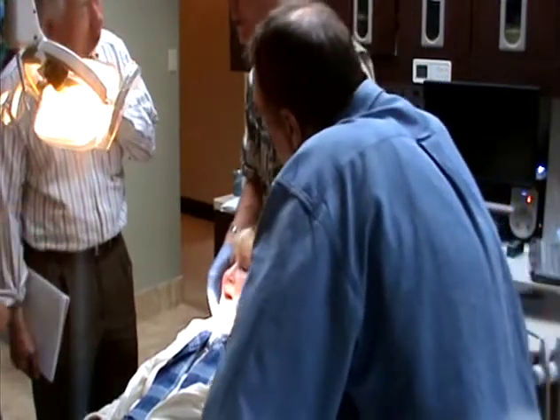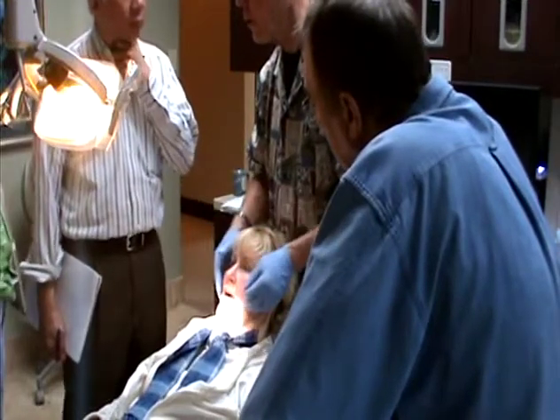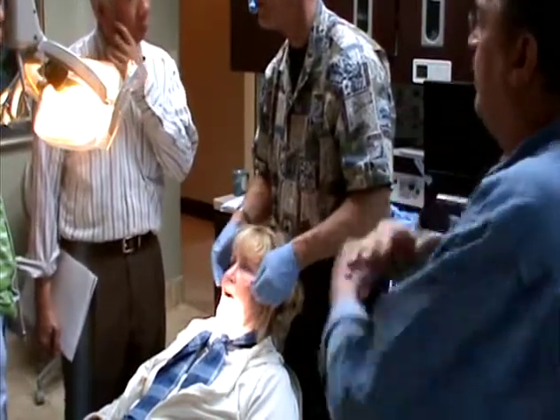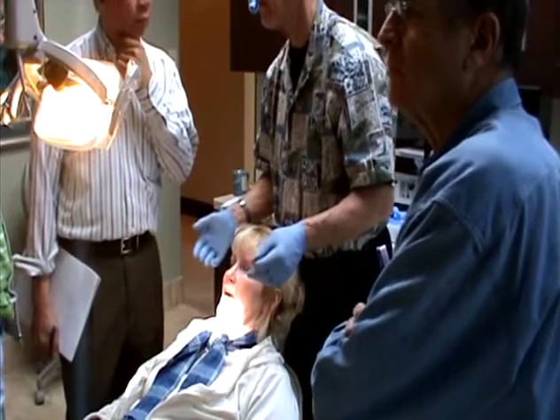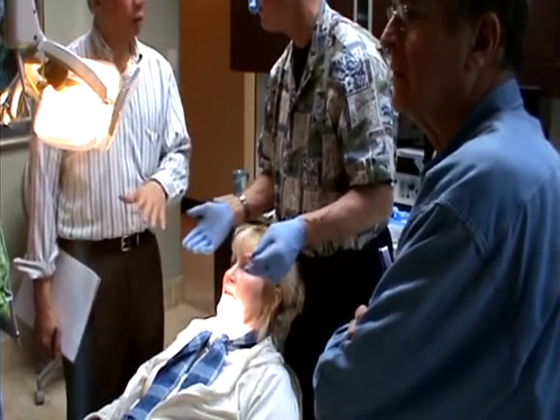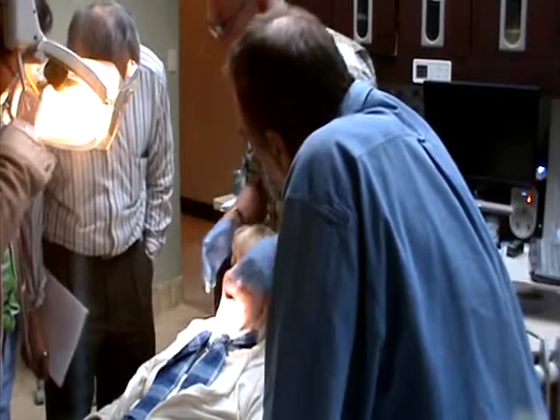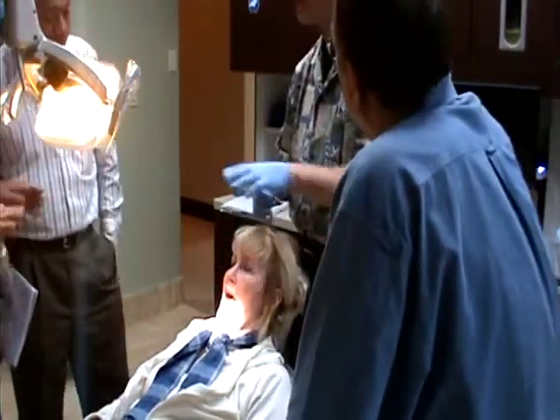And when she gets all the teeth erupted, then she's gonna make a diagnostic appliance, flat on top, put it in there and see where the jaw goes. Right now her system's rebelling, but it's gotta be done, because she's locked. Why don't we just flatten this? Well, she could flatten these composites. She made these all indented, but it should have been just flat, I think. Make them wide and flat, so they can just slide.